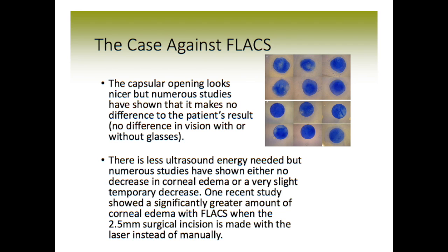We know that less ultrasound energy is needed with the FLACS technique because the contents of the lens are first softened with the laser prior to doing the phacoemulsification of the contents. However, numerous studies have shown either no decrease in corneal edema or maybe a very slight and temporary decrease. And one recent study showed a significantly greater amount of corneal edema with the FLACS technique when the 2.5 millimeter surgical incision is made with the laser instead of manually.